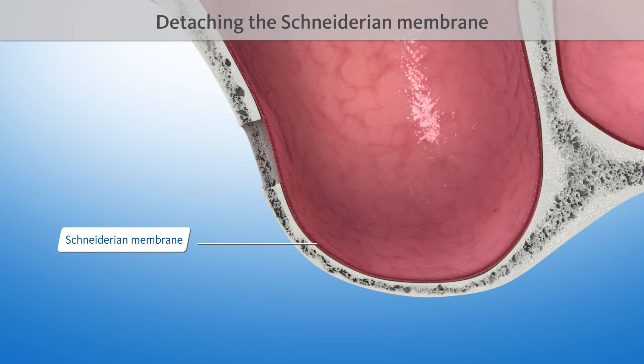Then, the tender inner skin of the maxillary sinus — the so-called Schneiderian membrane — is detached from the bone.